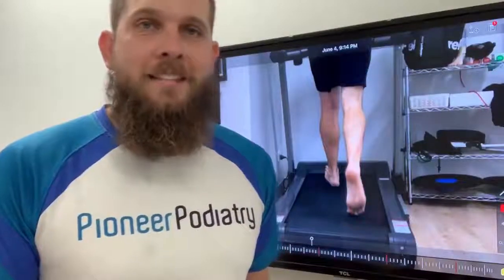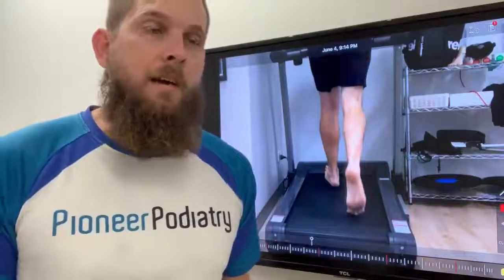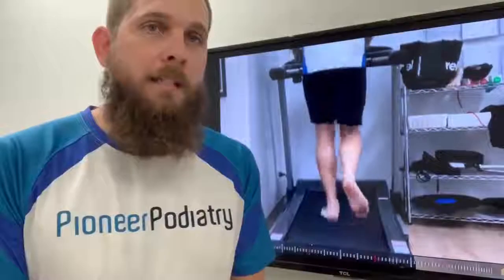So video gait analysis is when we use video to analyze your gait. So that's your walking gait or your running gait. It's particularly useful for athletes, but we use it for most of our patients when we're looking to educate you on the way your body is moving and how that could be contributing to your injury. Basically, I'm going to run through the main details of that.